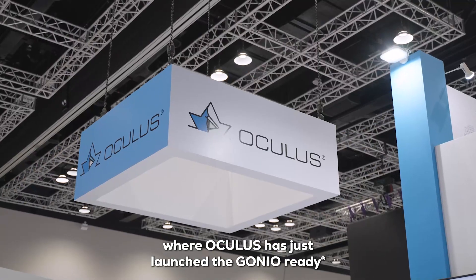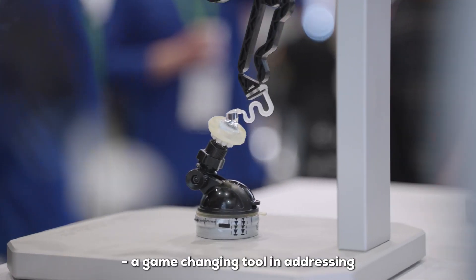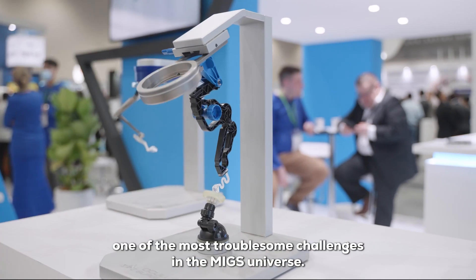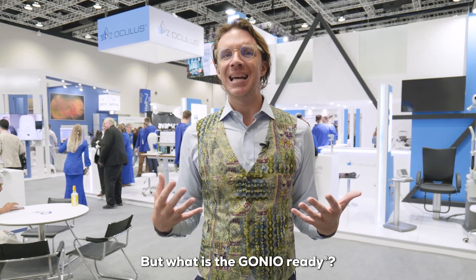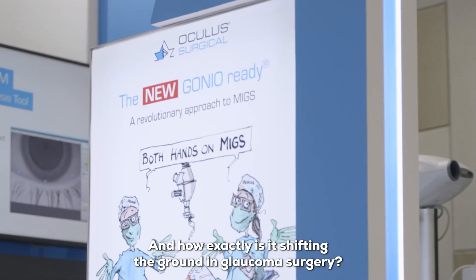Welcome to APAO 2023, where Oculus has just launched the GONIO Ready, a game-changing tool in addressing one of the most troublesome challenges in the MIGS universe. But what is the GONIO Ready, and how exactly is it shifting the ground in glaucoma surgery? Let's check it out.